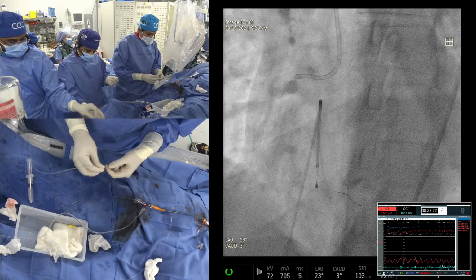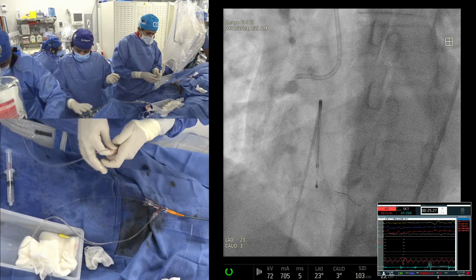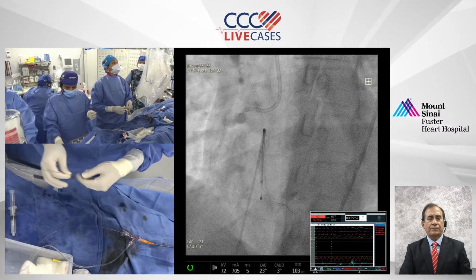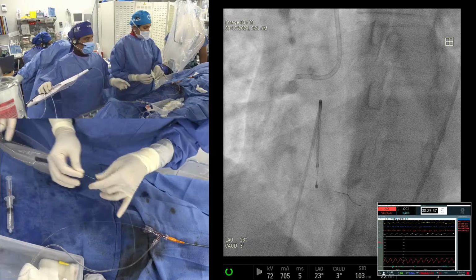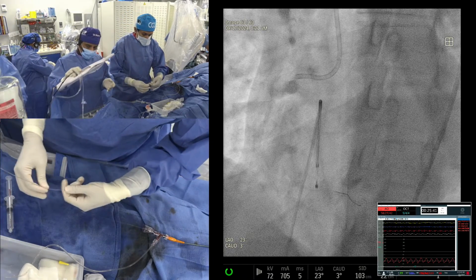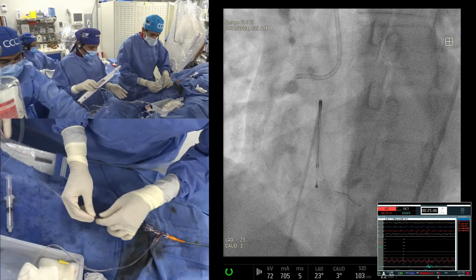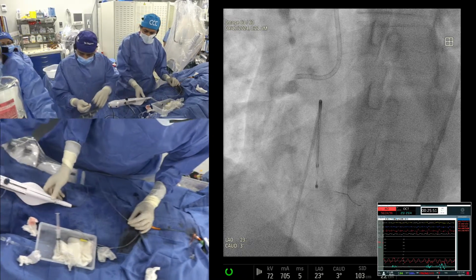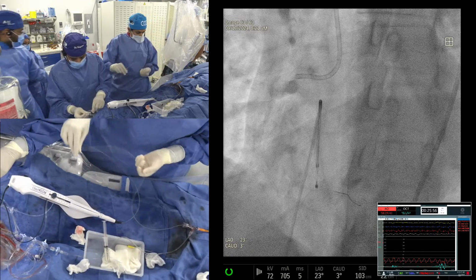So, I mean, your use over the last couple of years is also showing a trend toward a single burr strategy, no? No, that is true. And particularly now, in the era of IVL, if you need to use a second device, probably use IVL because that will be less harmful, with fewer complications and less chance of perforation. So by and large, it will be a single burr strategy, supplemented with rotatripsy with the approach. This case looks to be absolutely perfect for that. It's a large vessel, I think.